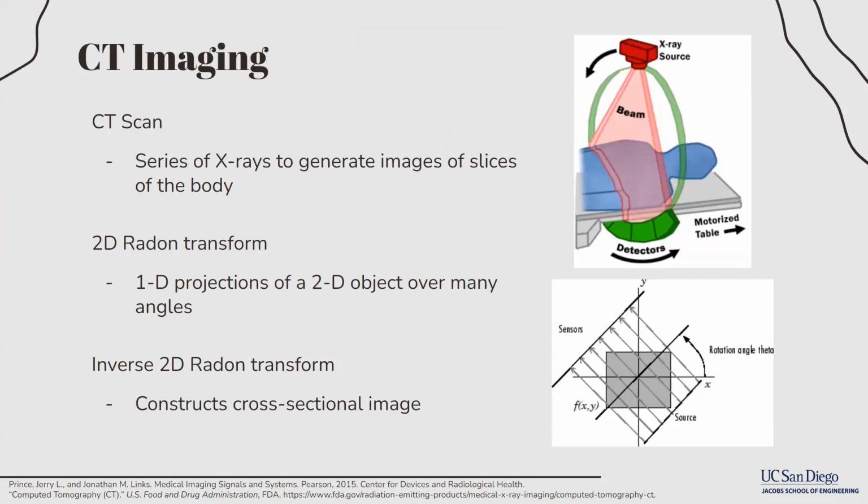So, a background on CT imaging. CT is an X-ray imaging procedure where narrow X-ray beams are aimed at a patient and quickly rotated around the body, producing signals that are then processed by a computer to generate cross-sectional images. Each X-ray line integral gives a 1D projection of a 2D cross-section of the body at any angle. So we take a collection of these line integrals across hundreds of angles to then reconstruct cross-sectional images.